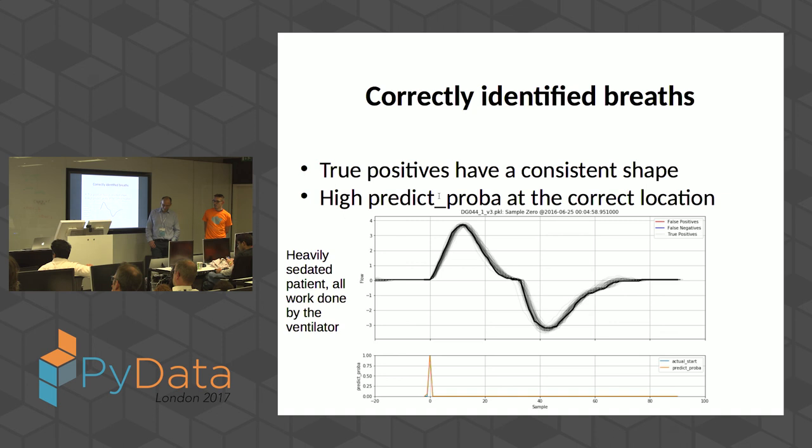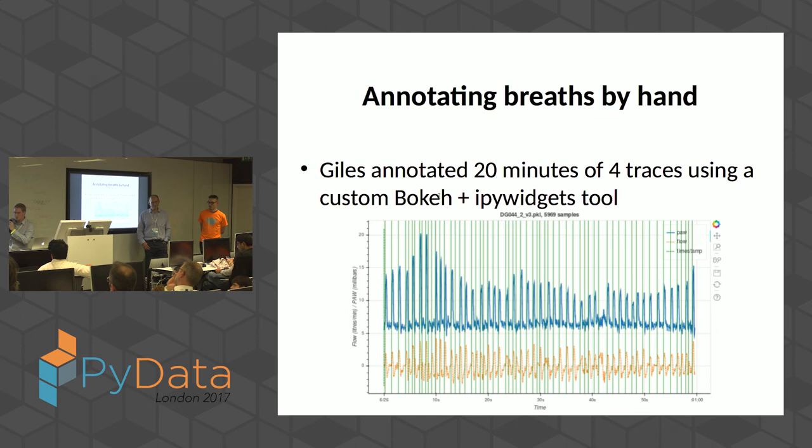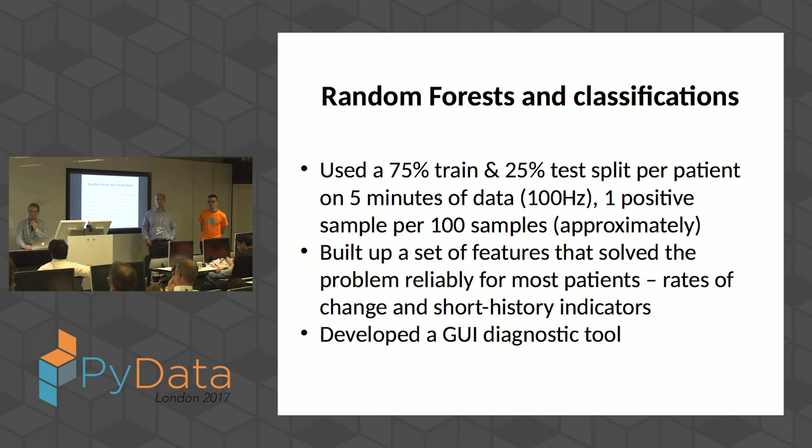We can be off by 10 milliseconds; if we're off by 100 milliseconds, that matters. If we're off by 10 or 20, that doesn't matter so much. But imagine all of these joined together end to end, and it gets you back to this portion of this plot. Does that answer the question? Yeah, okay. Might be a silly question.